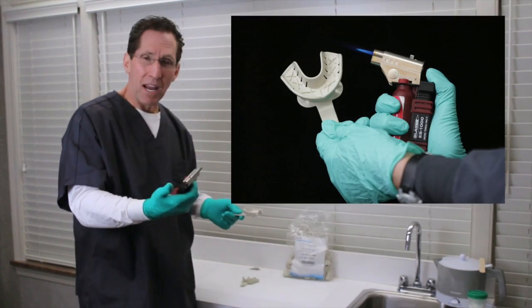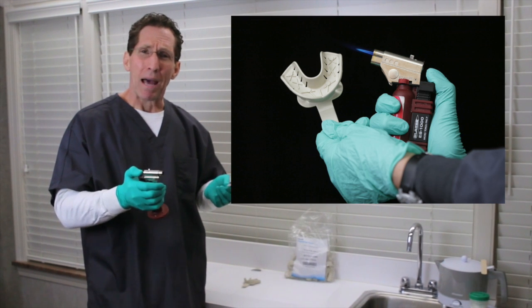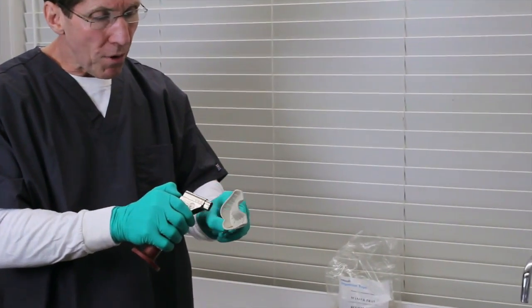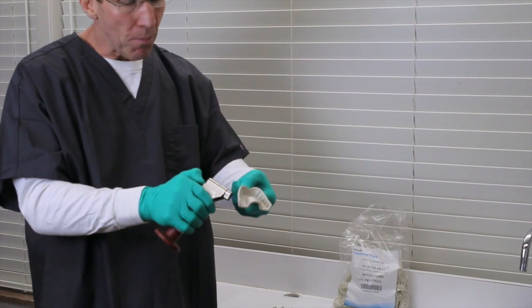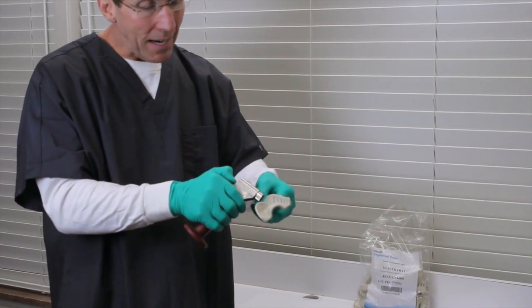We use one of these. In this case, I'm using a blazer torch. You can also buy inexpensive torches like at Bed Bath & Beyond, but some type of a butane or propane torch. And we'll just very simply go around the periphery of the tray. And this is something I will almost do routinely. As much as I like these trays, I typically find that to get the border molding and to get the soft tissue and vestibule form I like, I need to modify them.